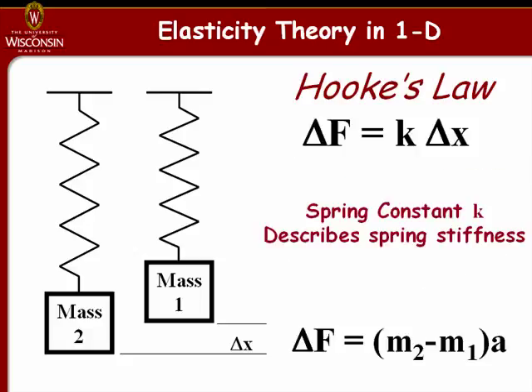And then we can associate those two through what's called Hooke's law. Hooke's law relates the difference in forces to the differences in deflection and allows us to calculate a spring constant that characterizes the stiffness of the spring.